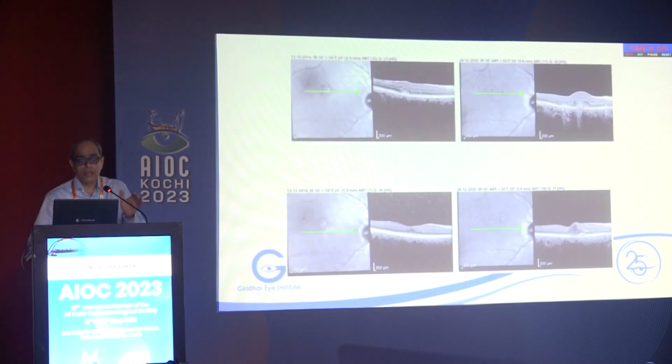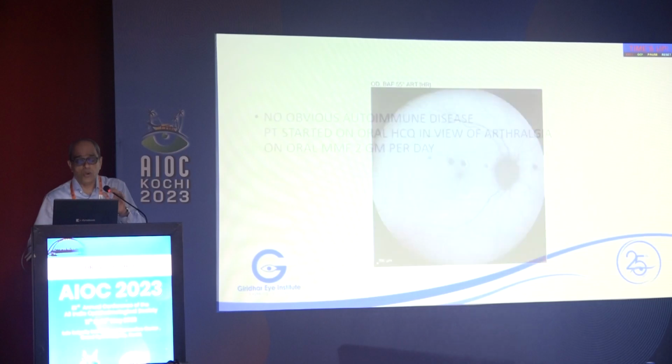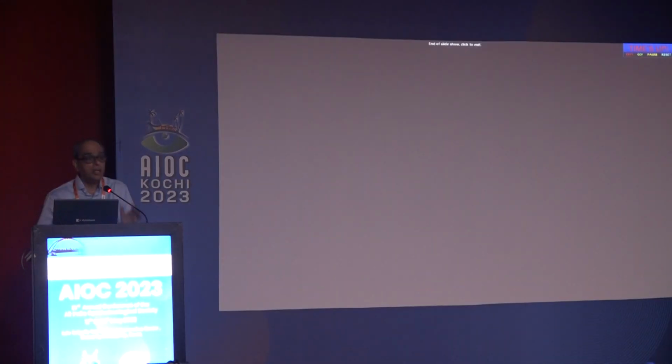So, in conclusion, multimodal imaging has a very, very important role to play in the diagnosis, prognostication, and follow-up of many diseases in the macula, and we should use it, titrating it according to each case. Thank you.